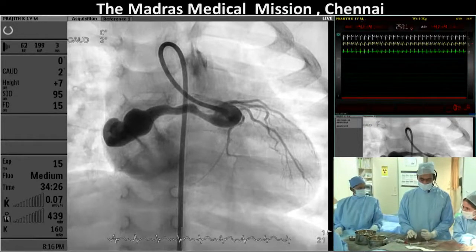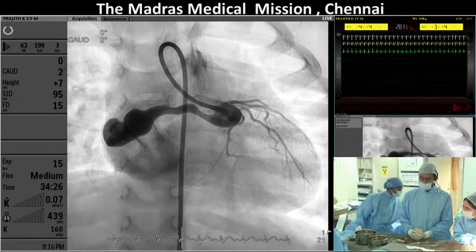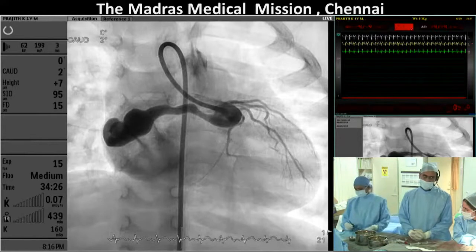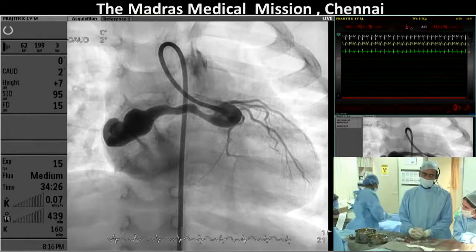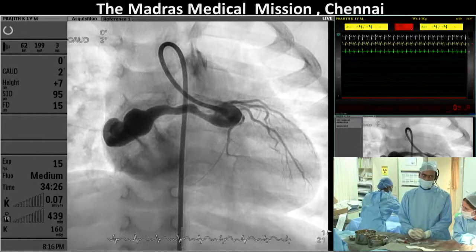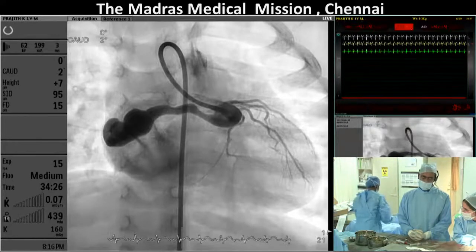So as long as you use a coil, and this is an unusual but not an unheard of anatomy, one of the safest ways to close this is to take a coil bigger than any coronary artery around, drop it upstream, and it will plug itself into the fistula's opening. I've probably done that 10 times out of 100. Okay, so you would go for a coil, Mansoor?